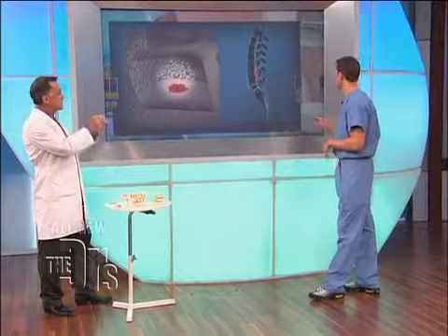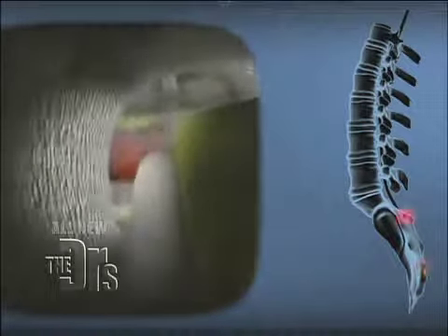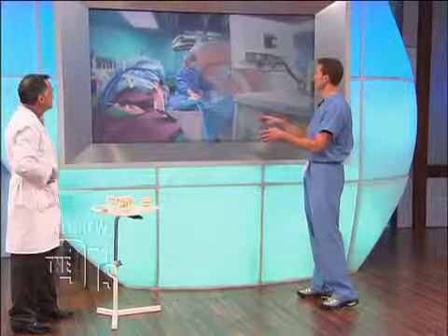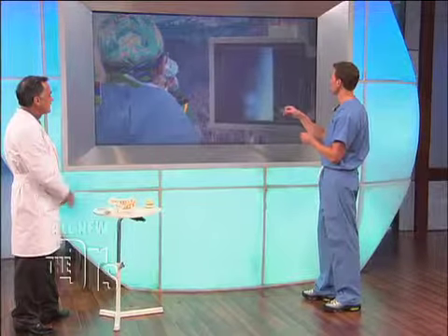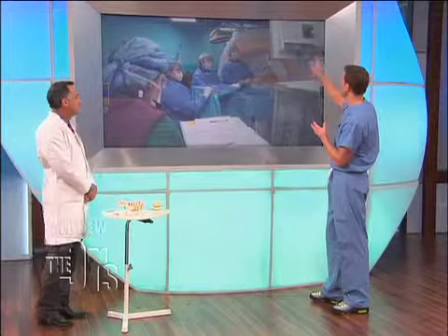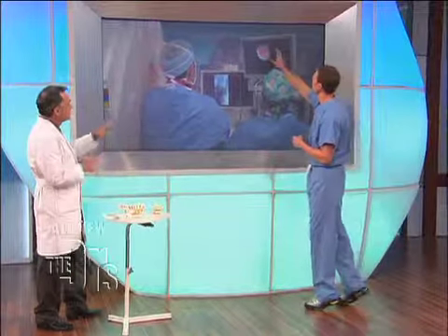That's exactly what we're doing. With traditional surgery, we open the back and have to remove bone to find the disc and remove it. With the laser through this small skin nick, we pass this small tube in and are able to accomplish the same thing. This is actually in the operating room — you're using a catheter to go through just as we mentioned, focusing in on that area with the catheter.